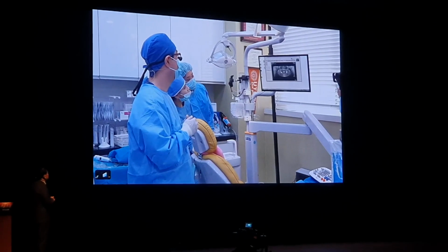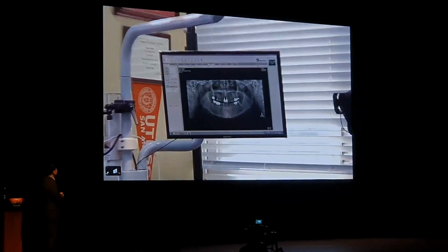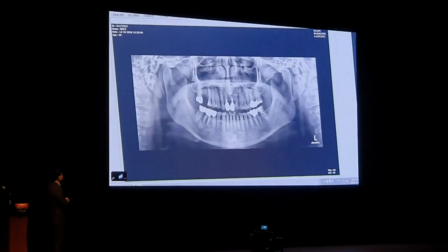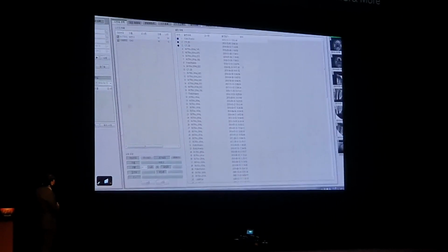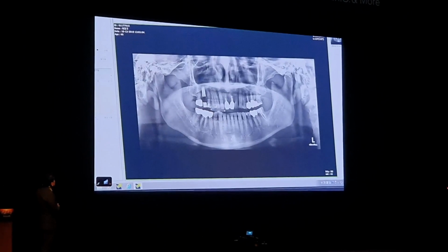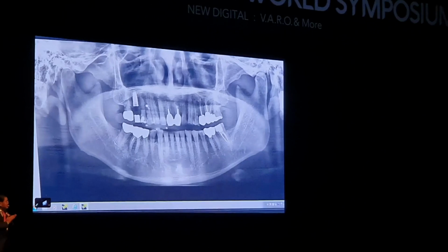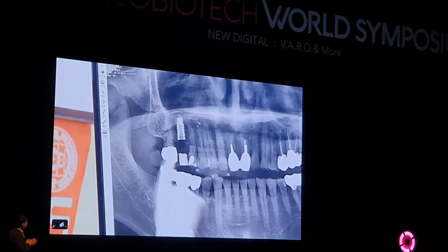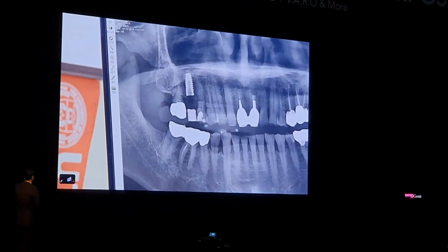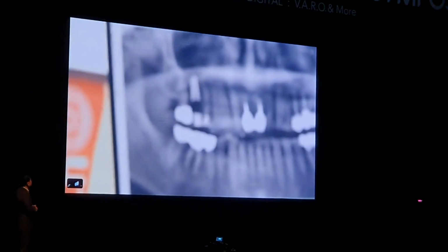Yes. So with zoom in. This is before the surgery. And this is the post-operative panoramic radiograph. Incredible. You can see the implant ideally positioned as planned, exactly engaged to the inferior cortical, and a thin layer of bone raised into the sinus. That's a huge clap from the audience here, Dr. Kim. Thank you. Well, I haven't done much really.